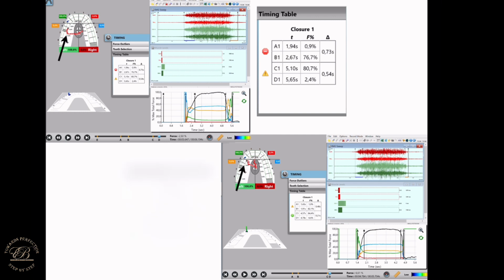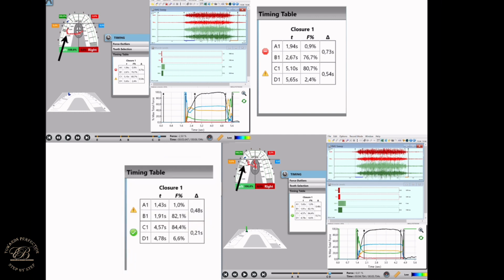You will now be able to see that the line is somewhat more straight up to the canine forces. The time frame has been reduced by more than half, and we are quite happy with that result.